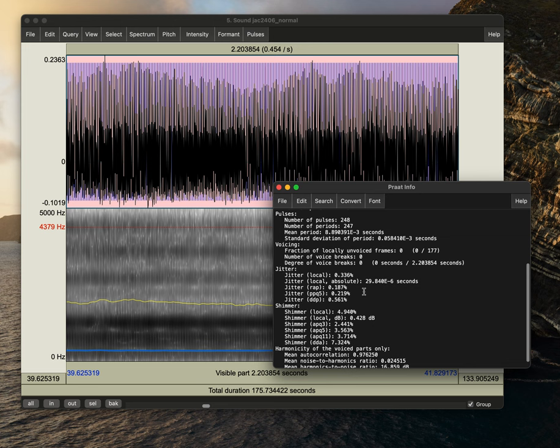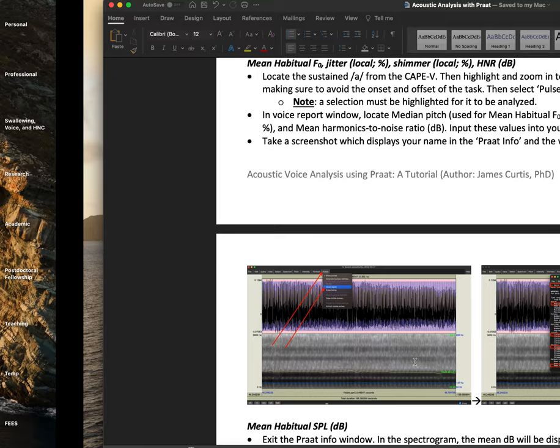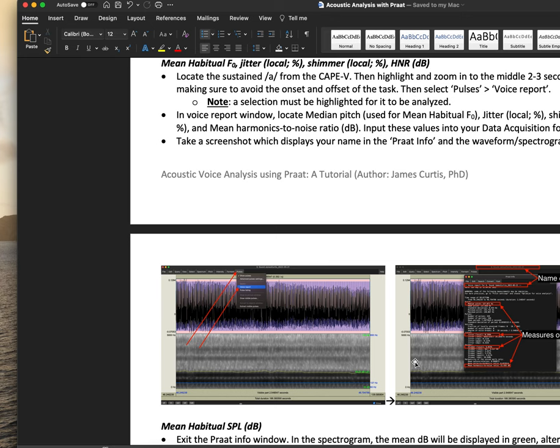And we'll notice here that we have our median pitch, which we'll use. We also have our jitter, our shimmer, and we use the local percentages and our harmonic noise ratio. So those are our four measures that we very quickly and easily get.